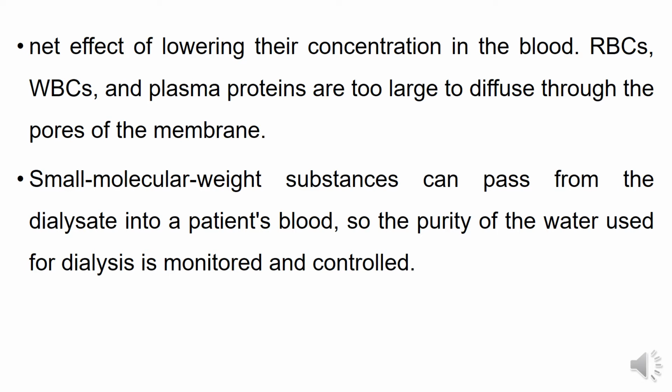Here the RBC, WBC, and plasma proteins are too large to diffuse through the pores of the membrane. Small molecular weight substances can pass from the dialysate into the patient's blood.